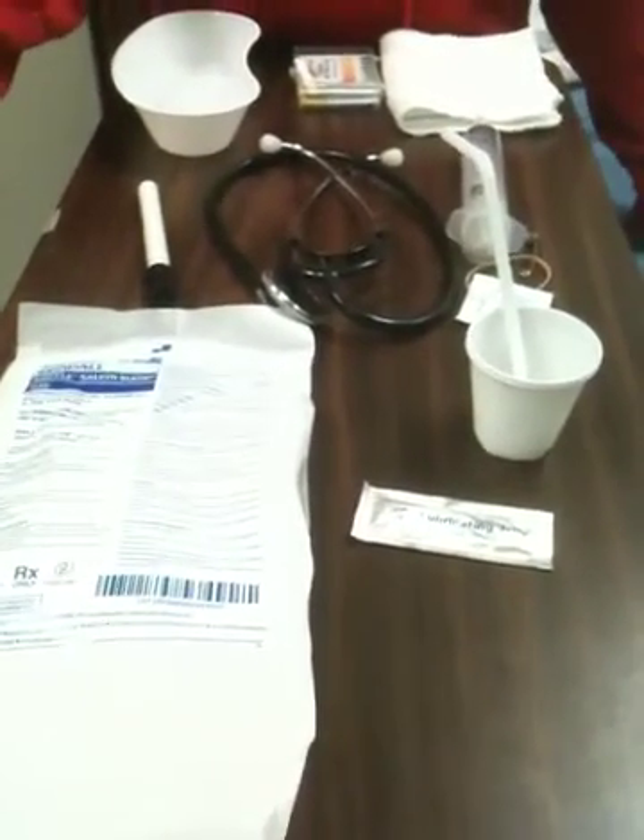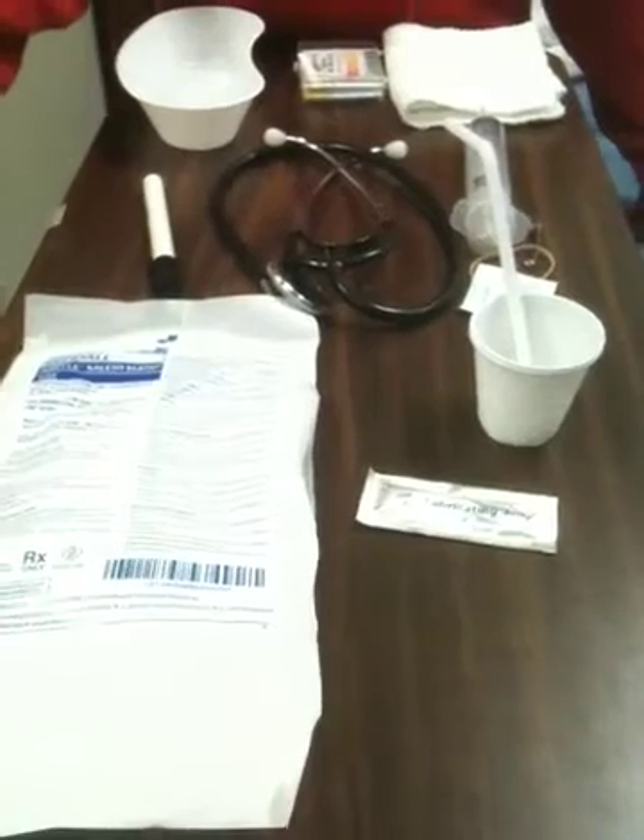We can give the patient nutrition like a feeding nasal gastric tube, but for this demonstration we're going to do a Salem sump tube, which is for gastric decompression. The first thing we're going to do is check and verify our order, identify our patient, and then verify and get all of our supplies ready. This is a Salem sump tube and we'll talk more about that in a minute.